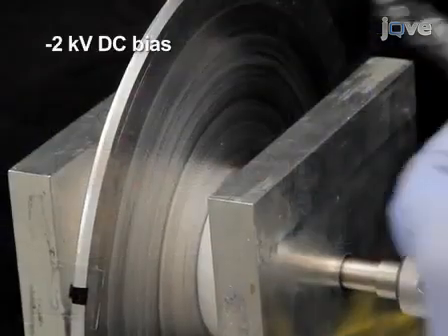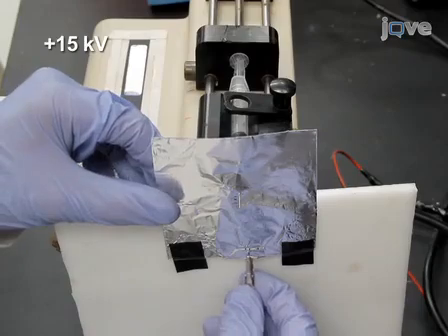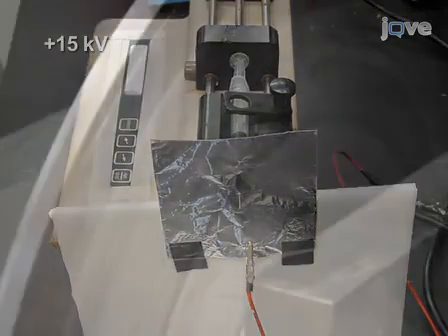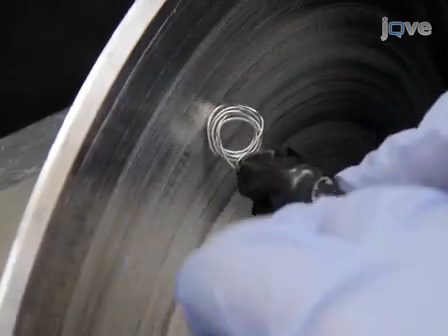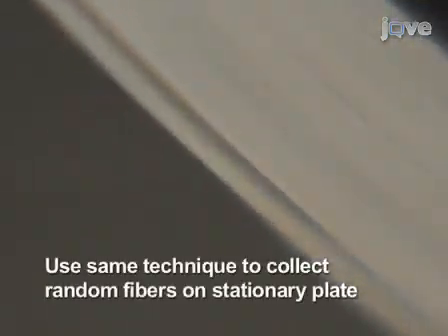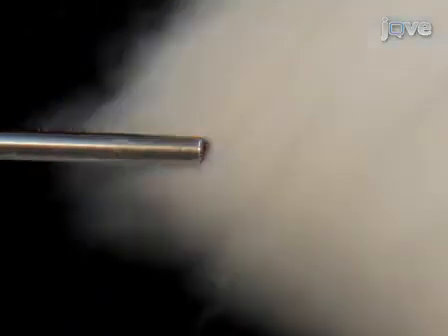Apply a -2 kV DC bias to the collector and +15 kV to the conductor plate, which is in contact with the metal tip. In the absence of access to a bipolar power supply, ground the collector. Start the syringe pump. Fibers will jet from the syringe tip and collect on the rotating wheel. Continue spinning until the desired density of fibers is obtained. To prevent clogging of the metal tip, periodically swipe it with a paper towel affixed to a non-conductive rod.